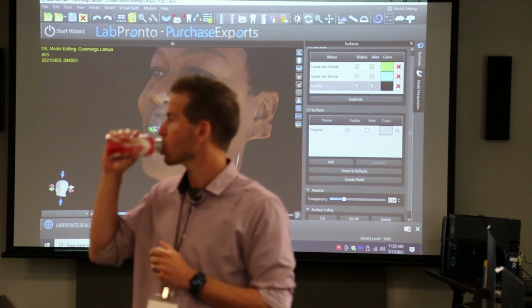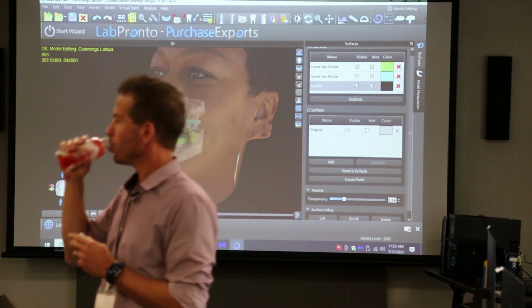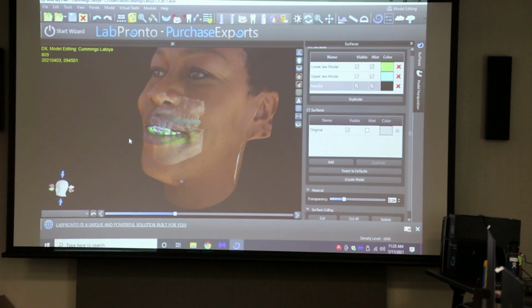Yeah. It works. I just need to get better at it. Yeah. The face scan thing? Yeah, play with that.